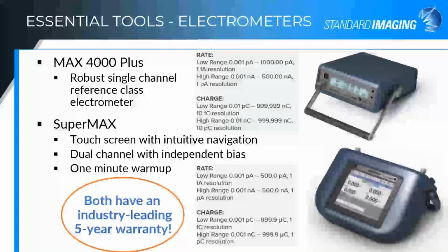Another thing to consider is warm-up time. Are you the sort of person who leaves your electrometer plugged in all the time and can use it whenever you feel like it? Or are you the sort of person who sets it on the shelf and then, oh dear, last minute, I need to run in and make a measurement because suddenly I have an opening on the LINAC, and that short warm-up time is really critical for you.